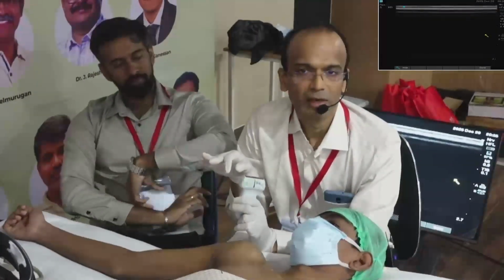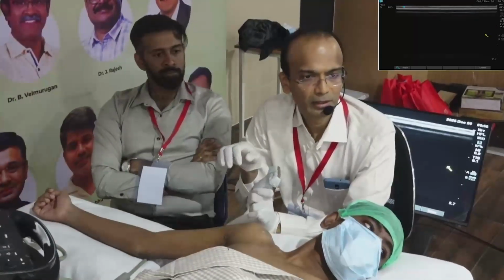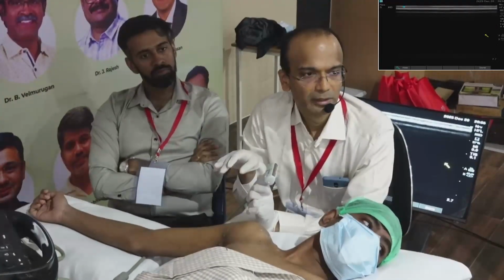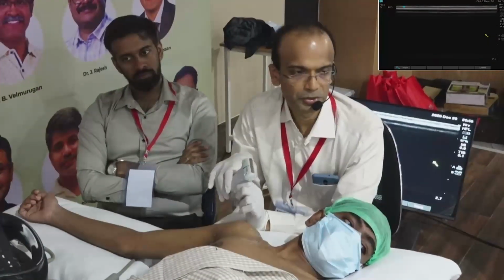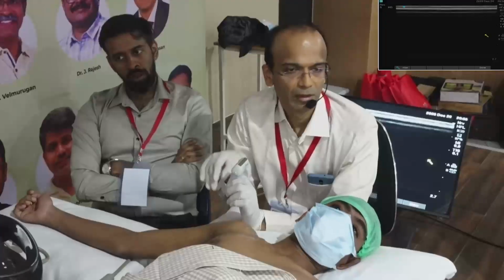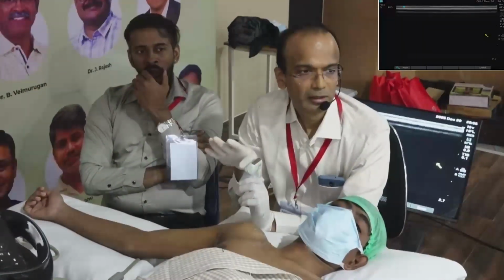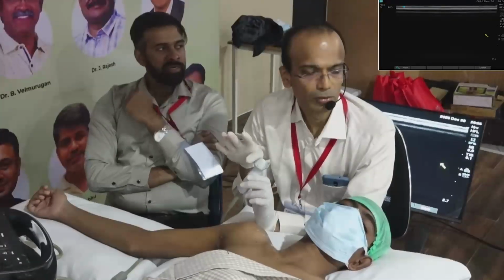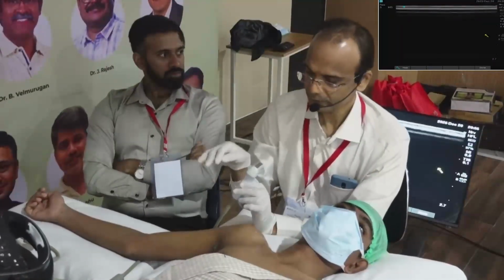To reduce it further, go for a costoclavicular block. If you want to totally nullify phrenic nerve involvement, you have to choose infraclavicular. Obviously we move away from the main components like roots and trunks the more distal we go.